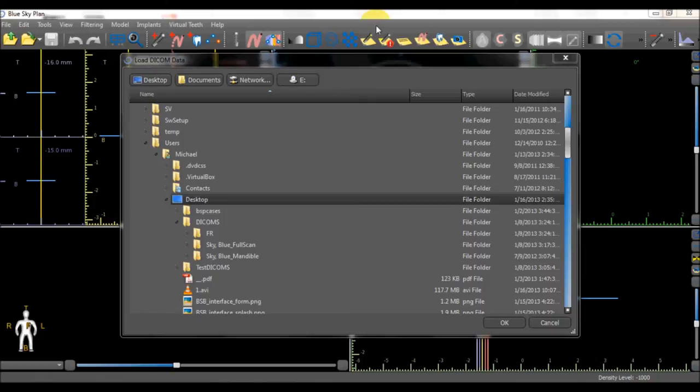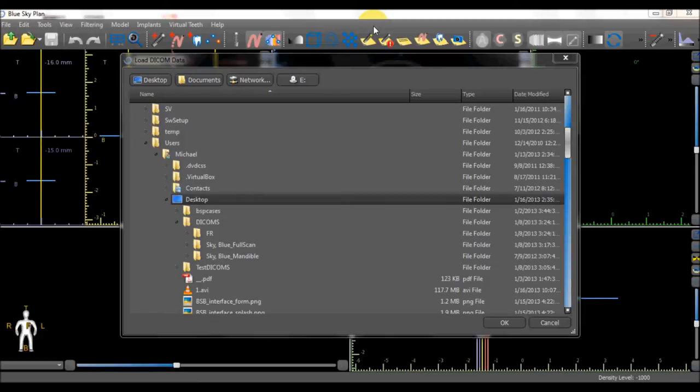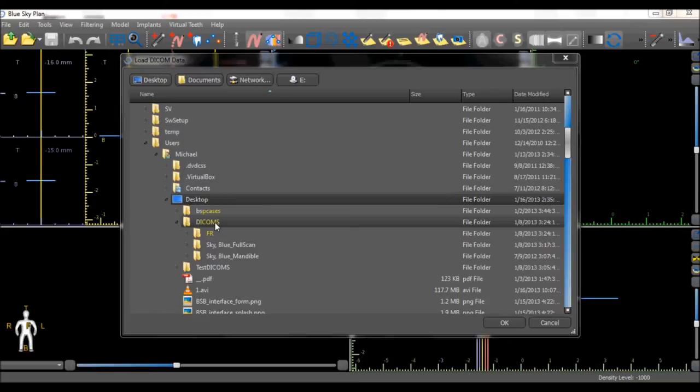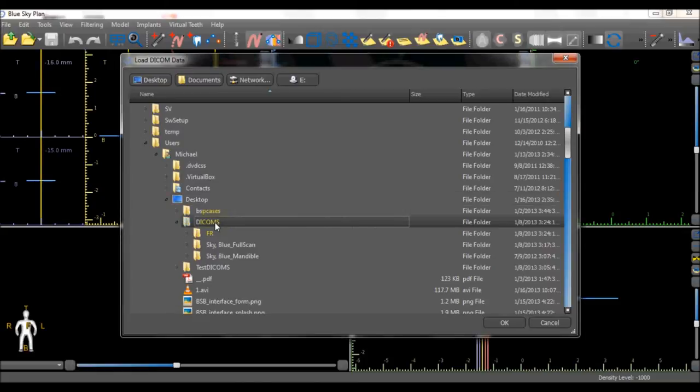To load a set of DICOM images, select the folder containing the DICOM images or the folder containing several sets of DICOM images. In this example, we're going to select the DICOMs folder which contains three sets of DICOM images.